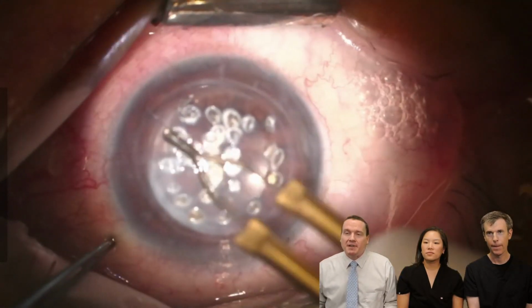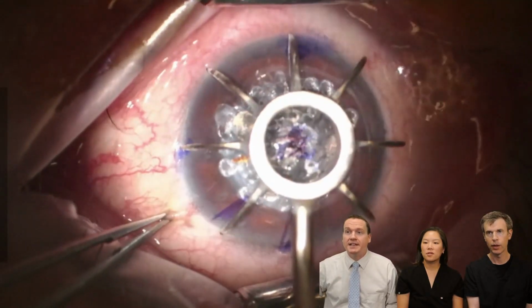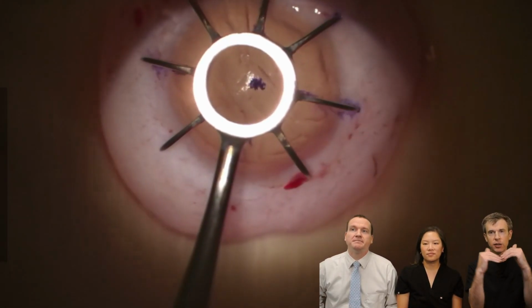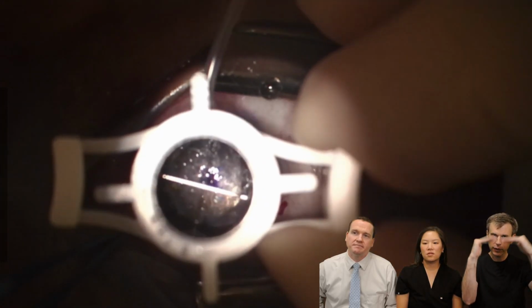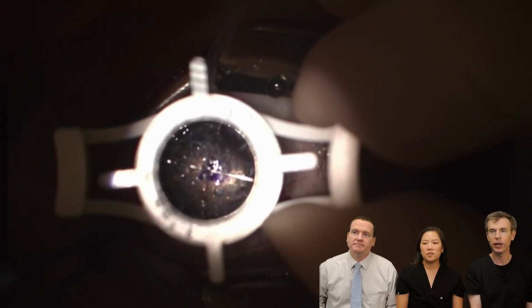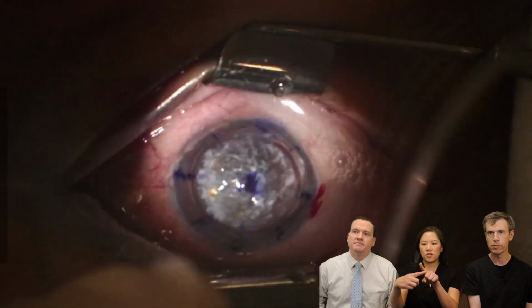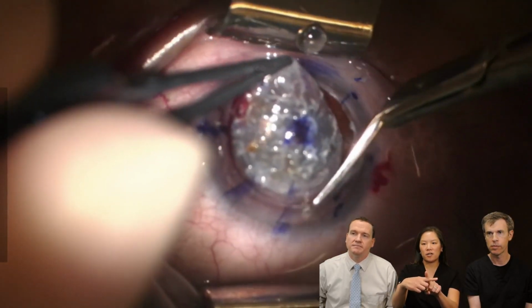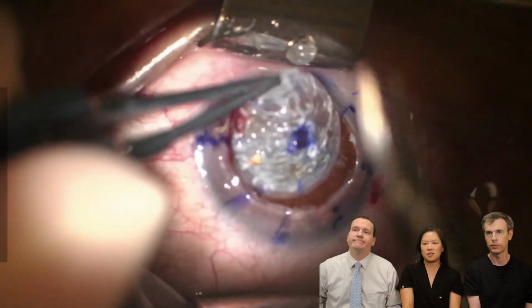but starting off with the cautery over the diseased corneal tissue that's about to be removed. The reason for the cautery is that it flattens. Otherwise, you have a very steep cornea, and if you then do a punch, you cut out way more tissue than you want. So flattening it out makes the next punch more reliable. So the trephine actually suctions onto the cornea. So that's what we're talking about, trying to flatten it out so that it actually maintains suction. Because if you can see in the center, there's also 2 wires. And so if your cornea protrudes too much, it's very hard to make that contact.